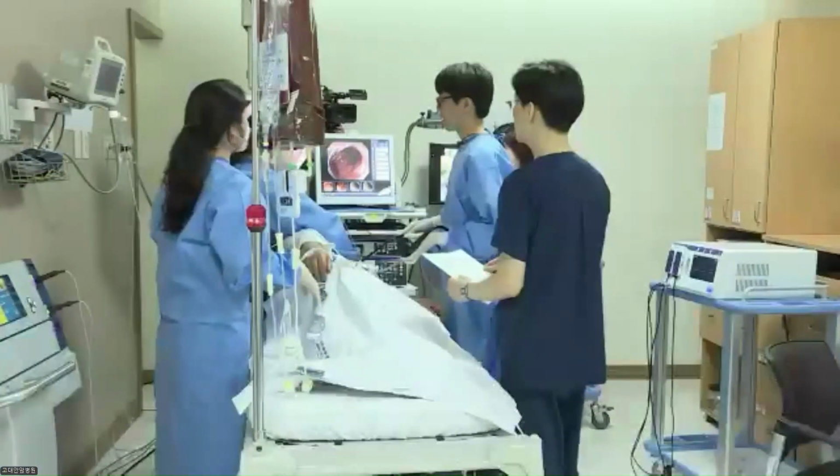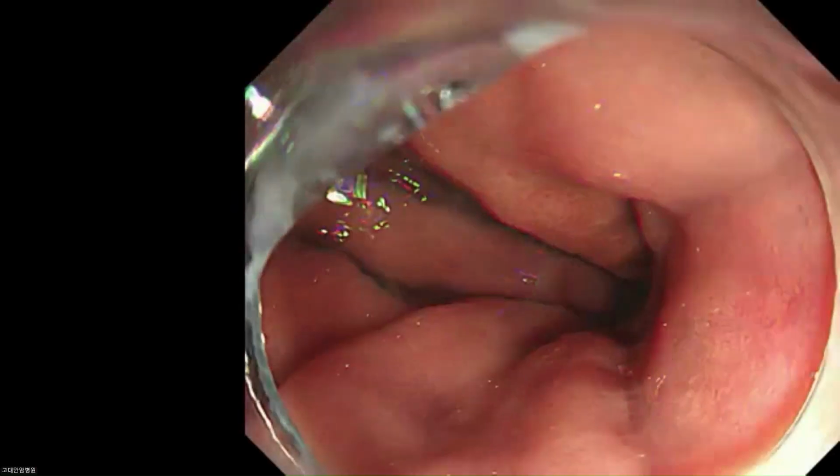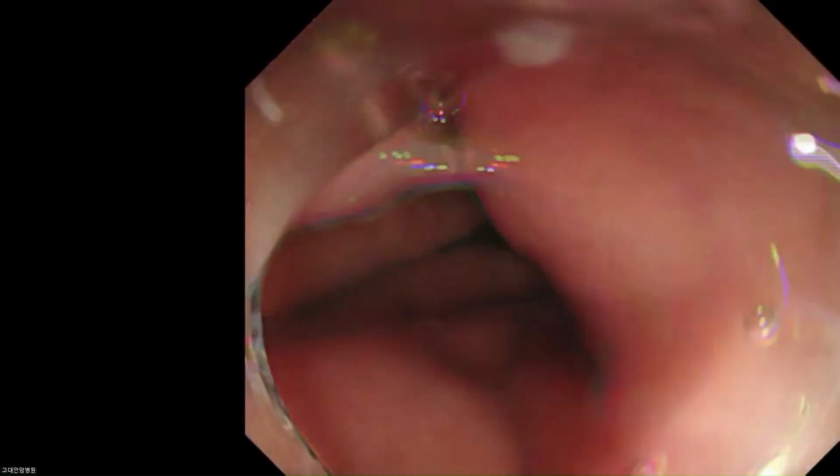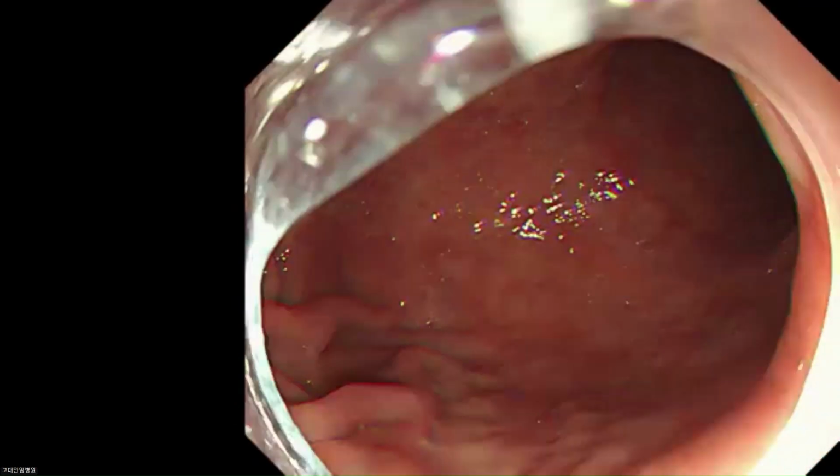Would you please start the procedure? Okay, let's start our procedure. Now I'm investigating the target lesion.